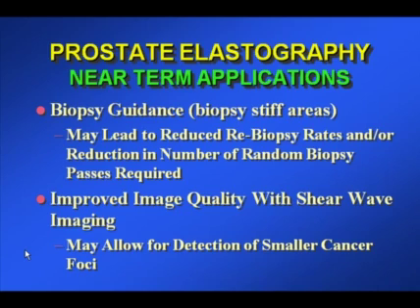With shear wave imaging, using one of the dynamic methods where vibration is applied to the prostate, the issues of compression by the endorectal probe may disappear, and it may allow for detection of smaller cancer foci, but this still has yet to be determined.